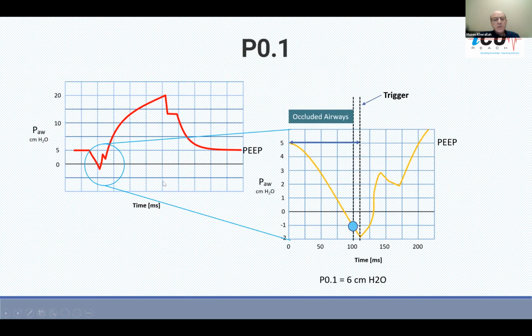You can measure the decrease in the pressure. When the impulses get into the diaphragm, the first thing that happens, of course, is the muscles contract, and then the pressure inside the chest goes down. Now, the first 100 milliseconds are very critical because they are not related to changes in the resistance or the compliance of the system. They are directly related to the strength of the stimuli to the diaphragm. And this way we can indirectly understand what happened at the respiratory center.